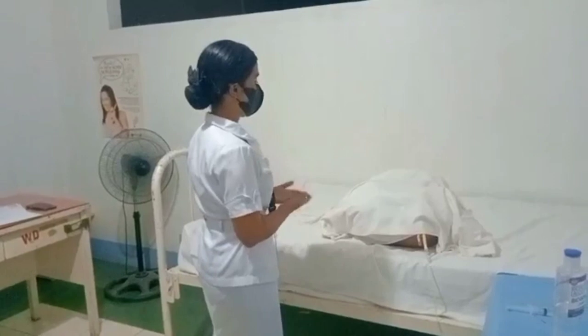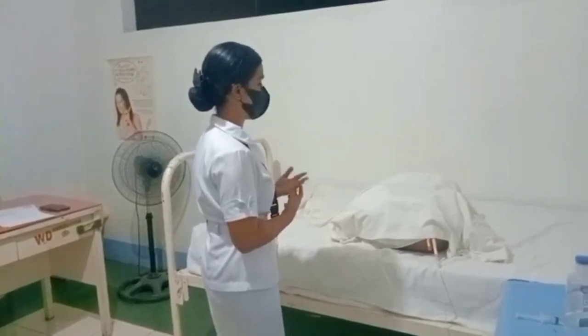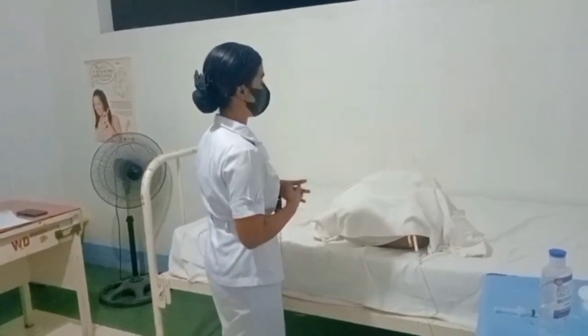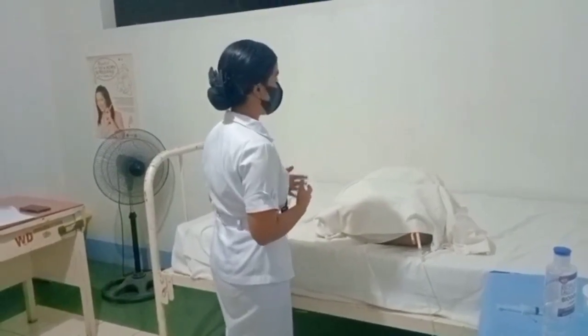So, good day ma'am. My name is Vanessa Delinos and I am from Luguni, Congress. And I am your student nurse for today. May I know your name and your birthday, ma'am? Okay. So for today, ma'am, I am going to assess the removal of indwelling catheter. So this is the removal of the indwelling catheter.